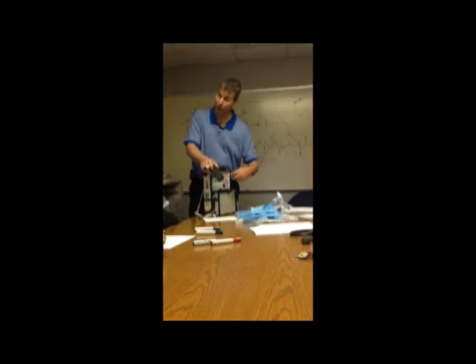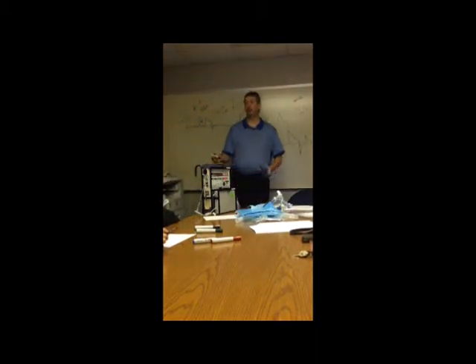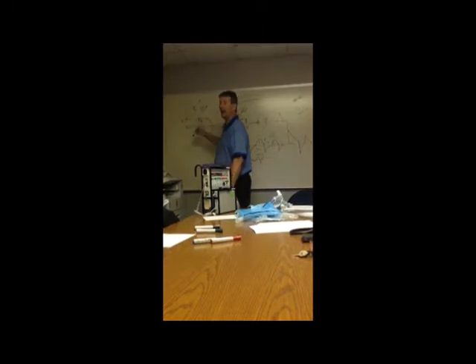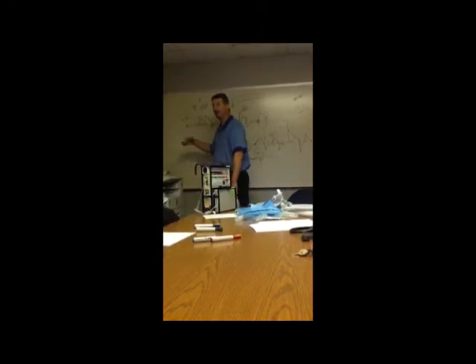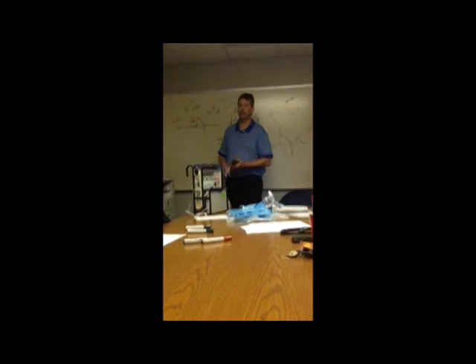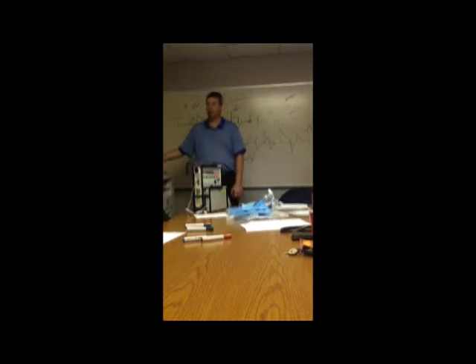If they say, I'm on 20 over 5, what's your peak pressure? 25, you know they're doing it like you do, and you don't have to do anything different. You set it just like theirs, okay? So the easy way is to ask what their peak pressure is, because 20 on top of 5 is 25. 20 with the 5 already included, like our BiPAP machines, the peak is 20. So you can gauge which way their machine is working by their peak pressure and what they say their IPAP is set at. Okay?